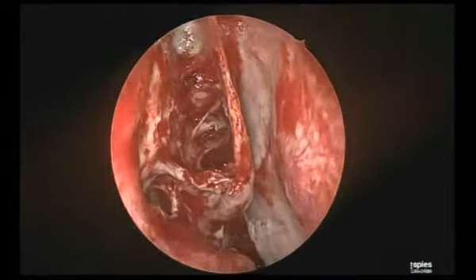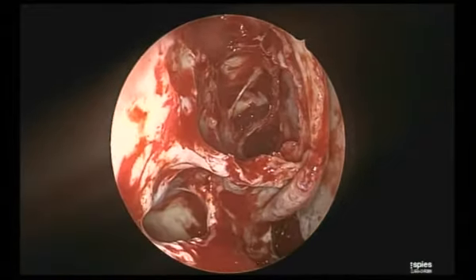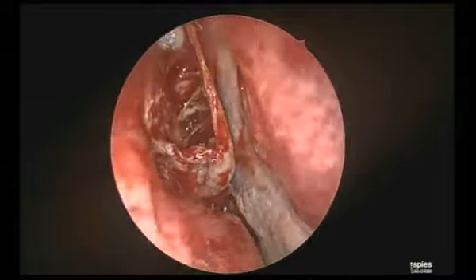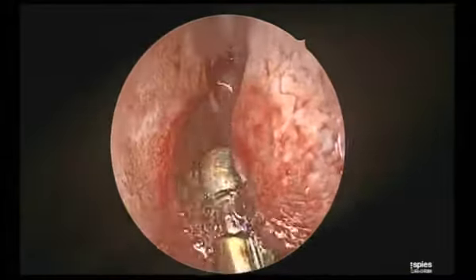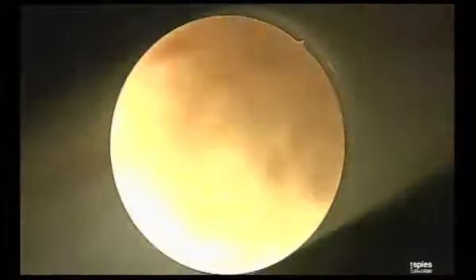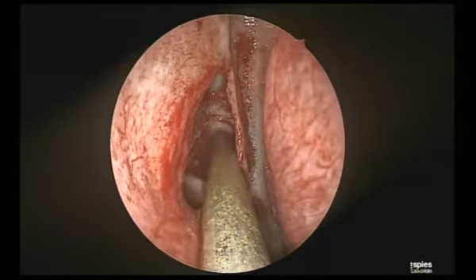So, see now. Should the maxillary be made bigger on this side? Right side, not really needed. This is very good. Had this been extensive disease, I would have done so much to the maxillary. Now first see the middle turbinate.